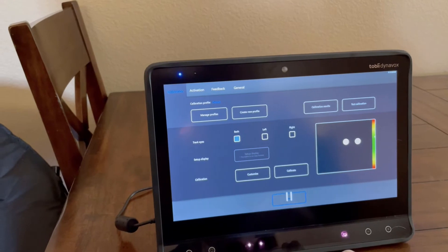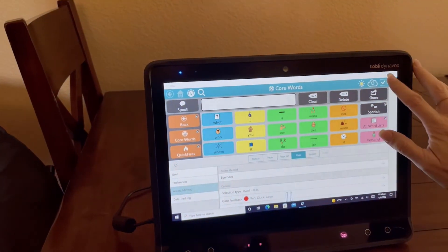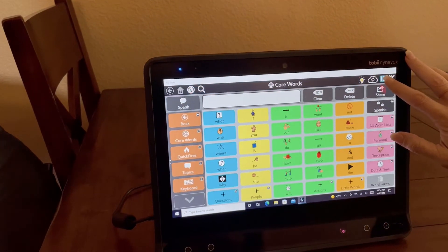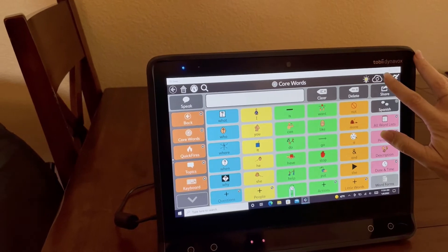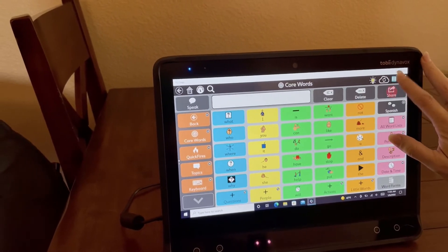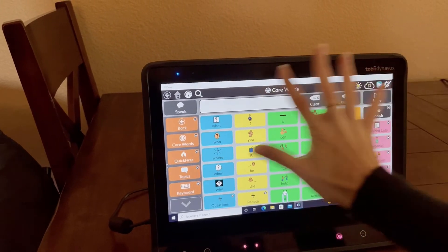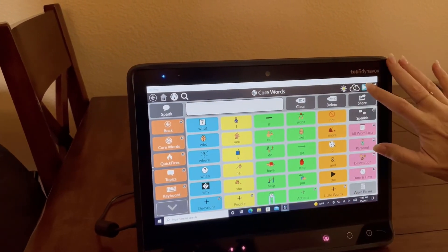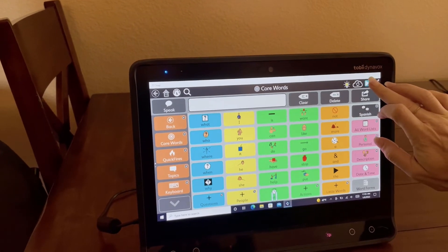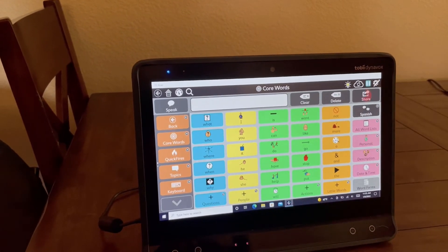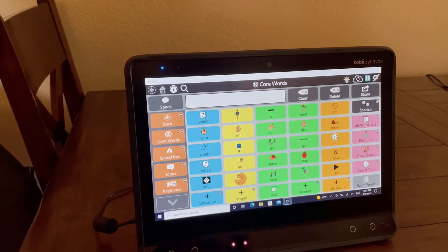Now I can close out of this. I can pause or play the eye gaze feature — if I'm editing I want to pause it, and if I'm ready to use it then it's set.